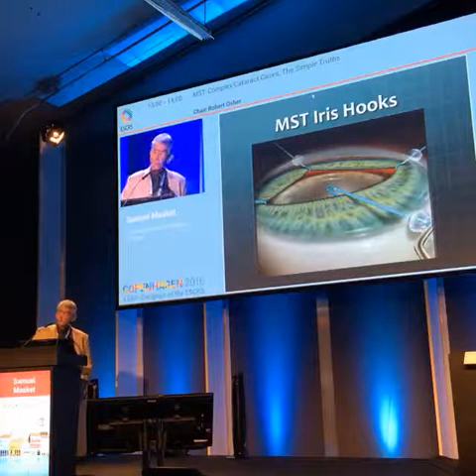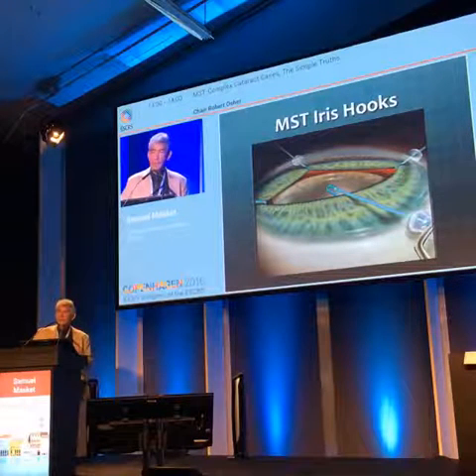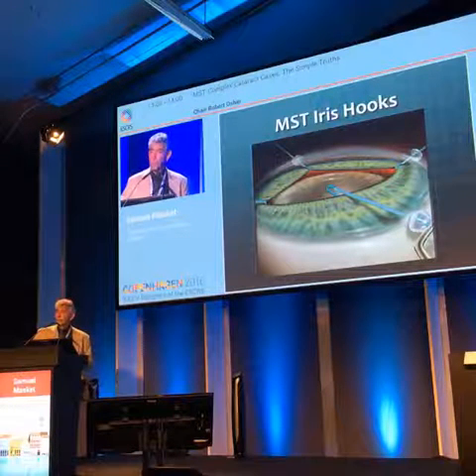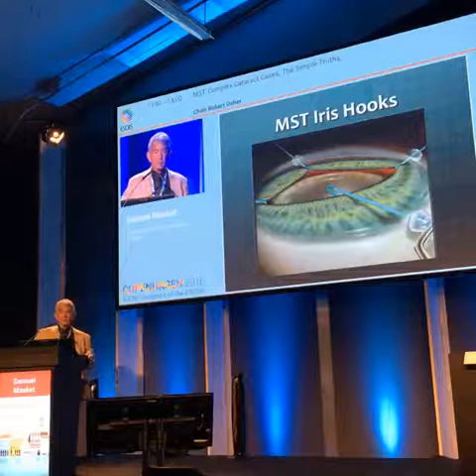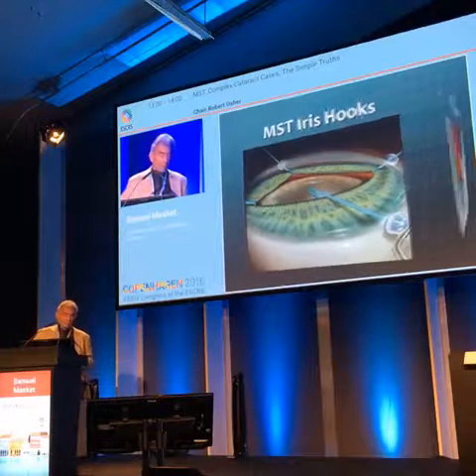We spent a lot of time talking about Boris's incredible device, and it really has made life so much better for all of us. However, we can't always use it. We're going to look at a couple of situations where I felt we really needed hooks rather than the ring.